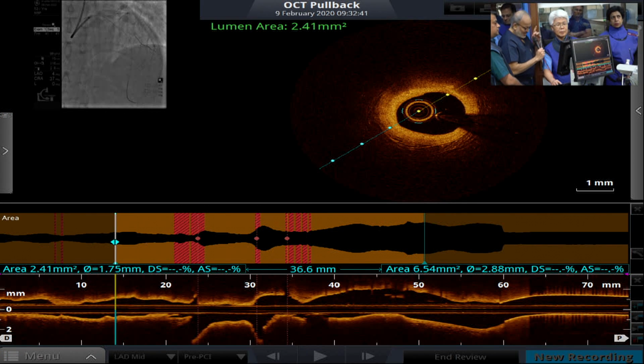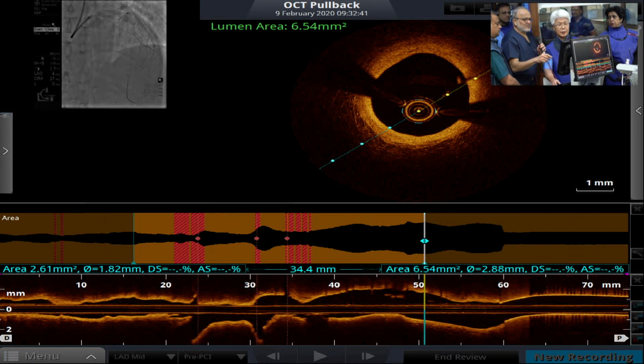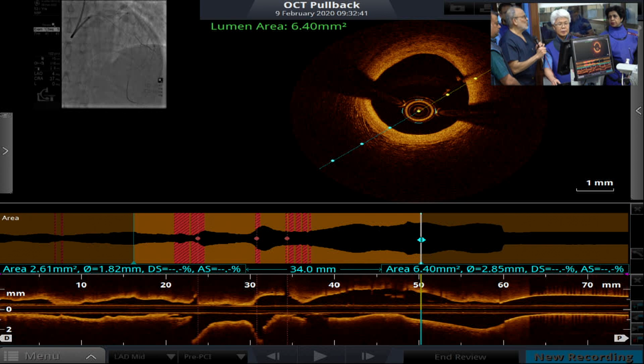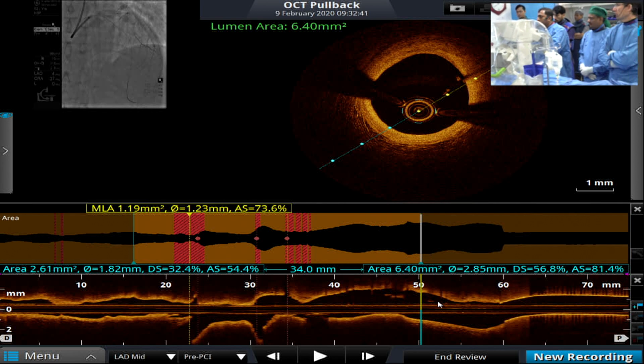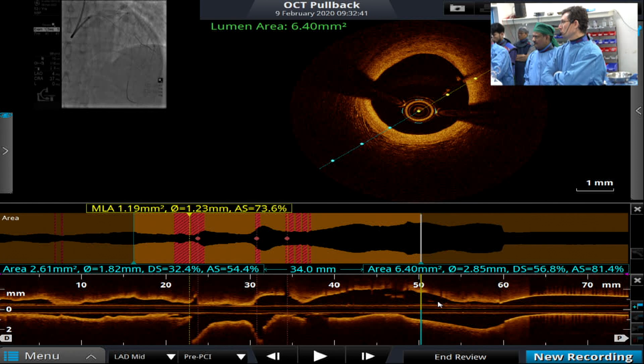2 millimeter stent. Yes. And length, we should probably do a 30 millimeter. 30 millimeter, and then you can post-dilate whatever, no problem. Yeah, it can go up to 3.2. Let's run the image. Yeah, 30 millimeter, 2.0 by 30, and then we can post-dilate the proximal part with a 2.75 or a 3.0.